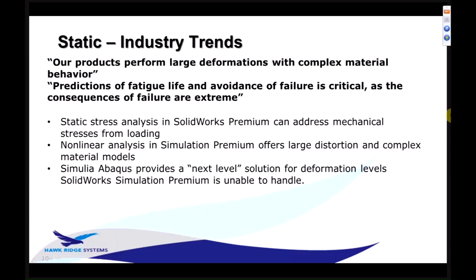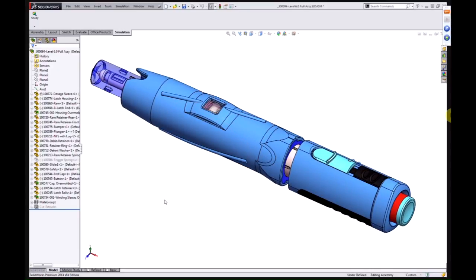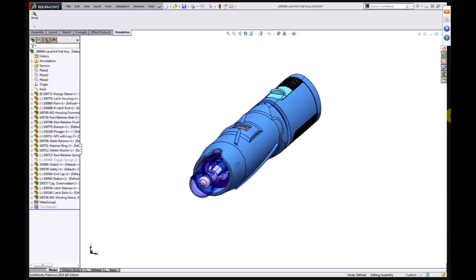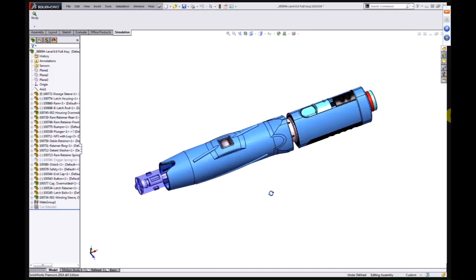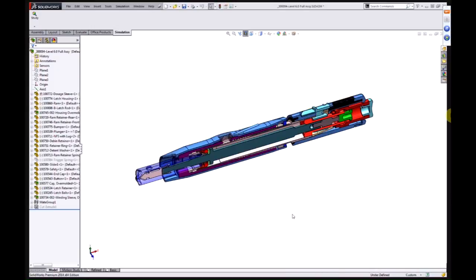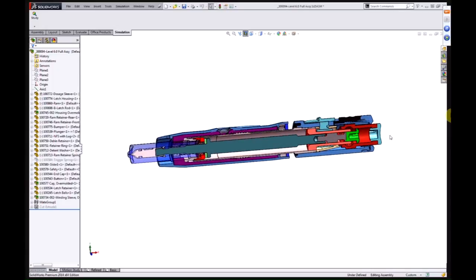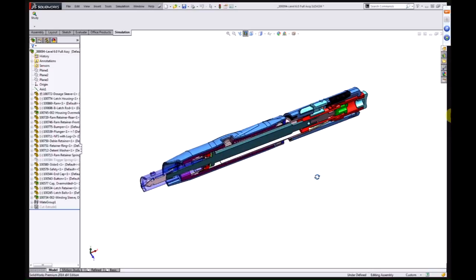Okay, so the first one we'll look at here is a Mediject insulin pen. The diabetics can inject themselves with insulin, a nice, easy to use tool. All right, we've basically got this mechanical part. A force on the top goes through the injection process to reload the insulin dose. And so you've just got all these plastic parts that interact mechanically.